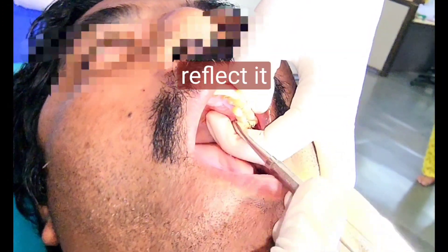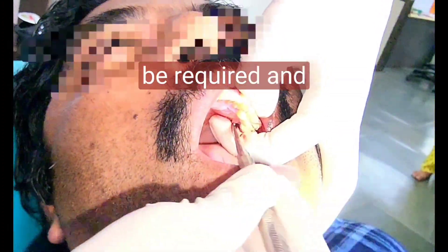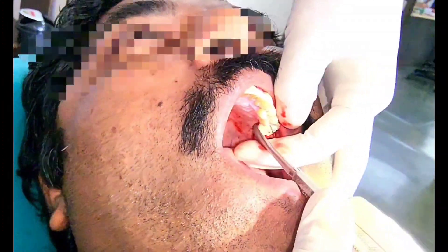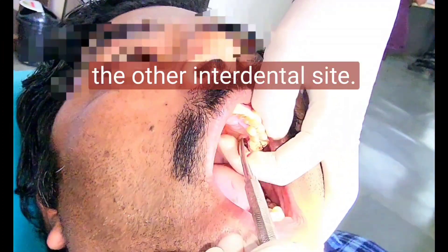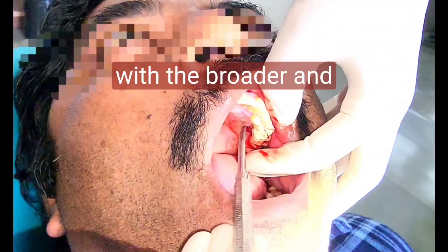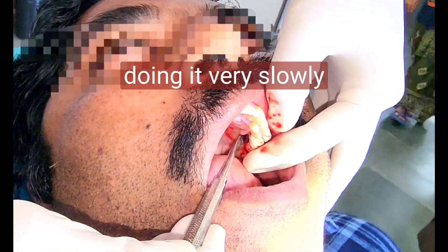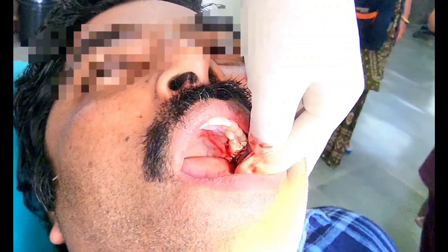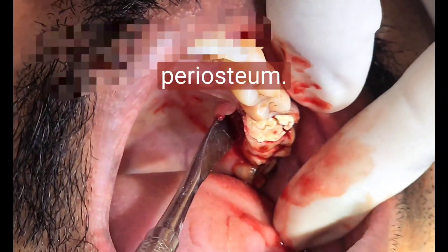That is why heavier force will be required. Start with the interdental region, roll it as you advance to the other interdental side. Meanwhile, keep pushing with the broader end, doing it very slowly. Your left hand should continuously support the periosteal flap.